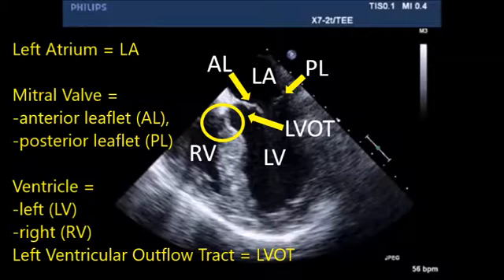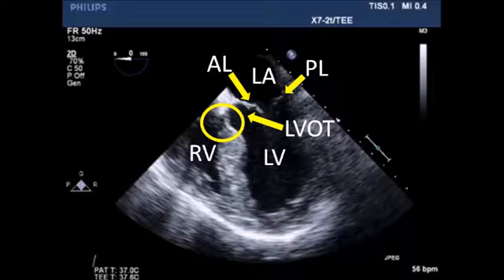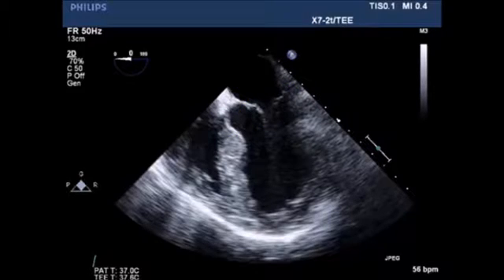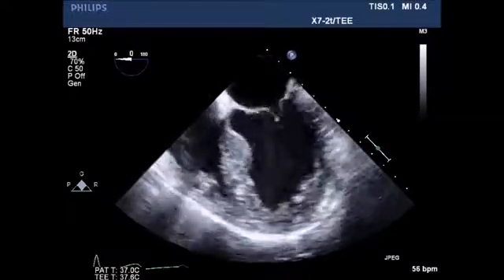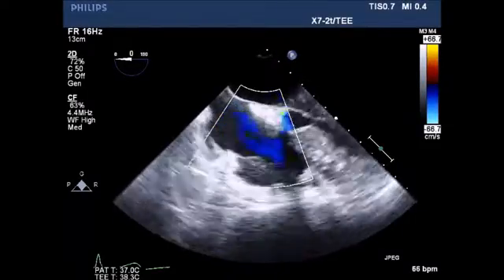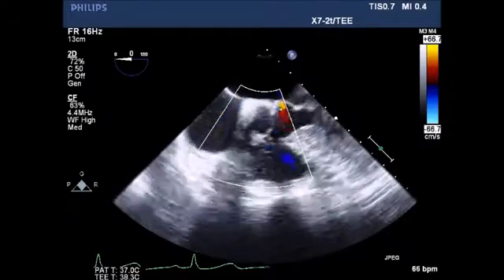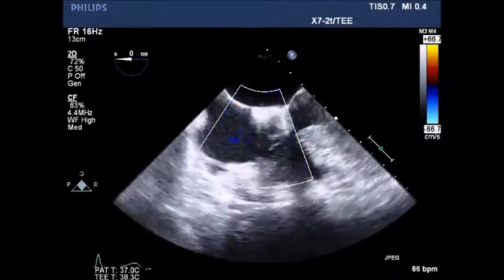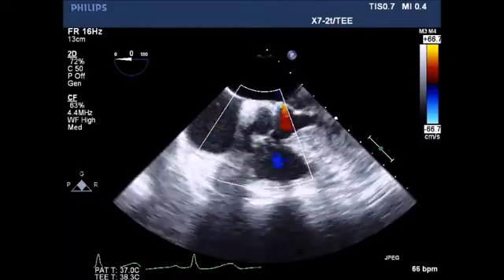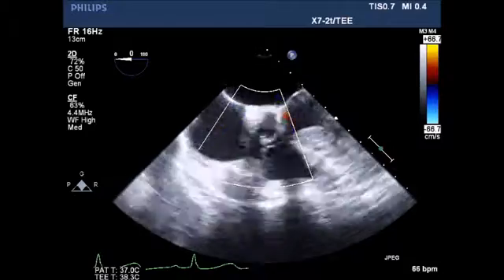The yellow circle denotes the area of the membranous portion of the ventricular septal area. Note the mild systolic anterior motion of the mitral valve. The patient had normal ventricular function. View of the right ventricle with some mild tricuspid regurgitation noted.